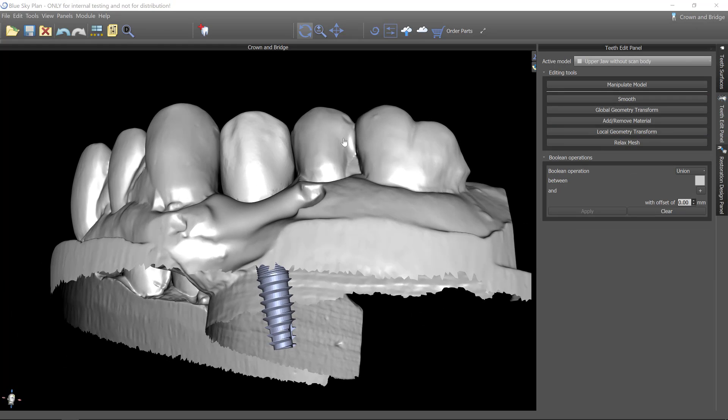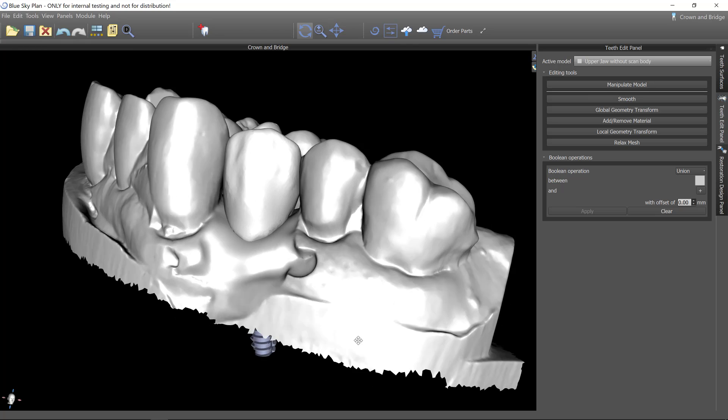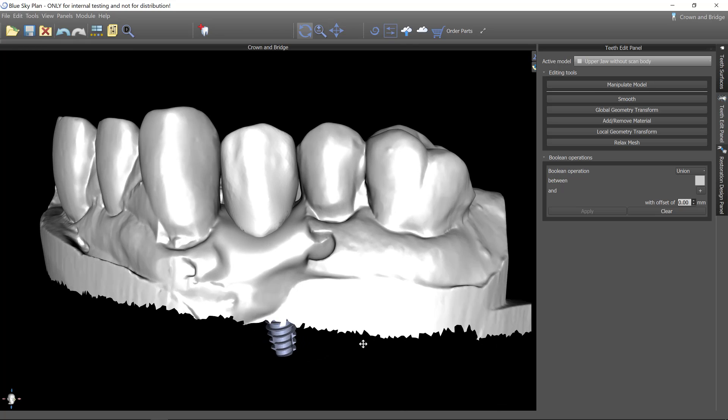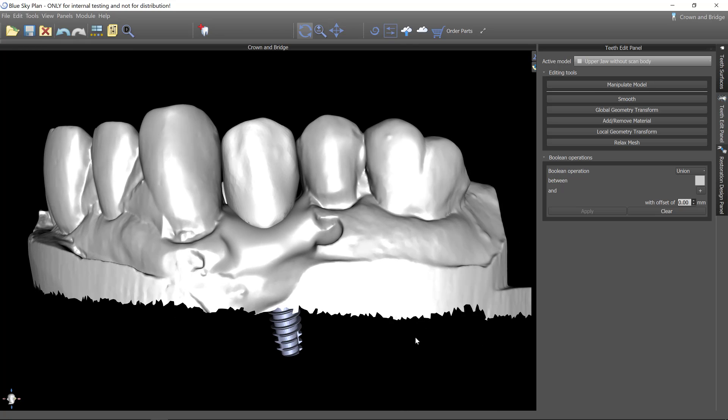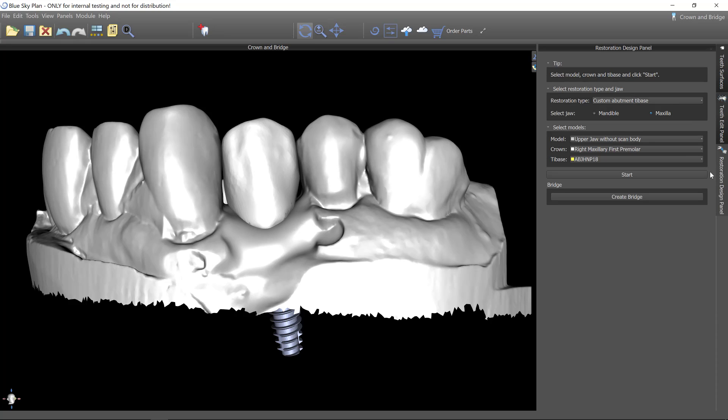So now that the tooth is designed, we're ready to go ahead and proceed with the designing of the custom abutment. I'm going to go to the restorative design panel and we're going to build this as a custom abutment tie base.